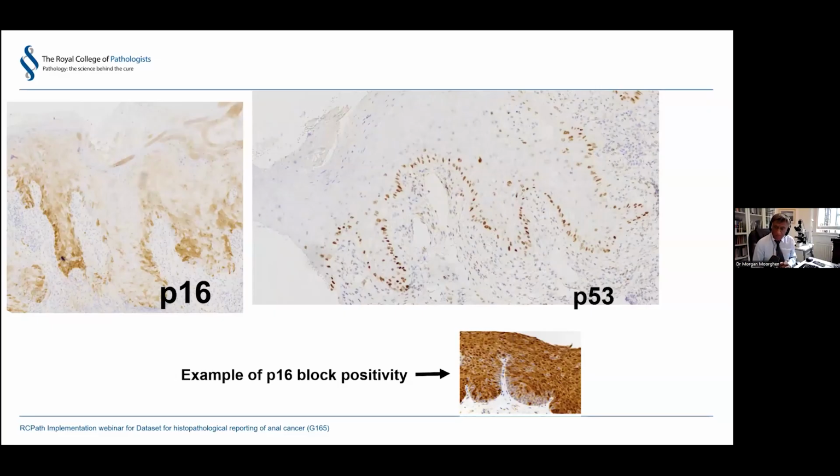And there will be cases where the P53 will be positive, but then it's a bit of an overstain. So that's also a problem. When the P53 is negative, then we've got a bigger problem, because I've come across one or two of these cases. In the anal region, GI pathologists haven't seen many of these, but this is a more common lesion with regard to the gynae tract, where people talk about lesions like VAM, vulval aberrant maturation, and DEVIL.